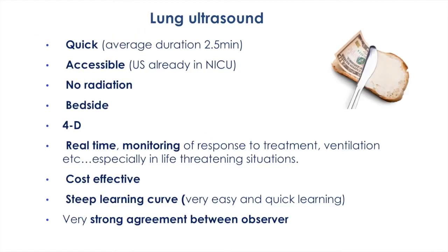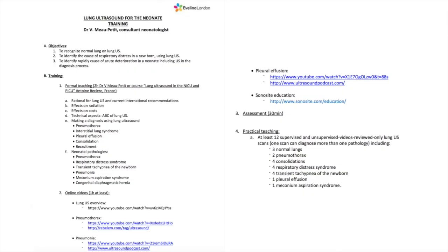So to summarize, lung ultrasound is a quick exam with an average duration of 2.5 minutes once you are experienced. It's very accessible because we all have an ultrasound machine already in our NICUs. It is radiation free. You can do it bedside, 4 dimension. You can do it real time, monitor the response of your treatment, your ventilation, especially in life-threatening situations. It's very cost effective with a steep learning curve, and there's a very strong agreement between observers.